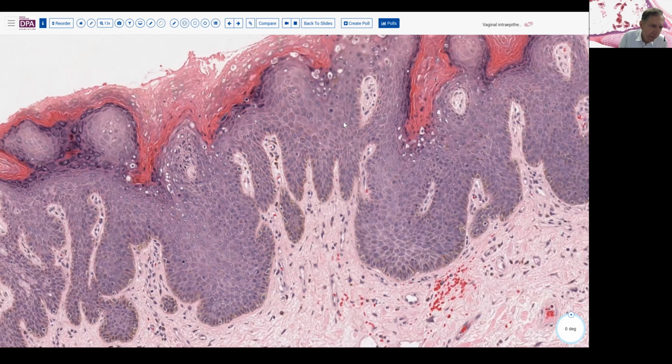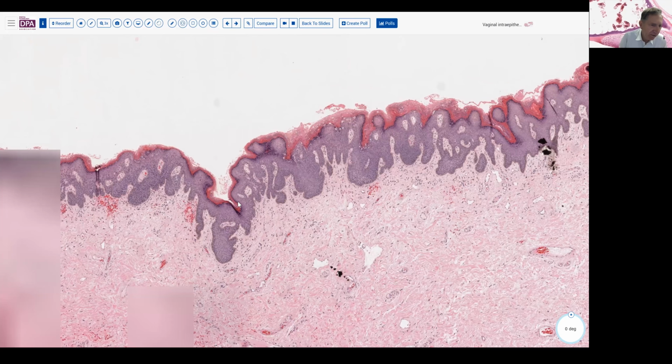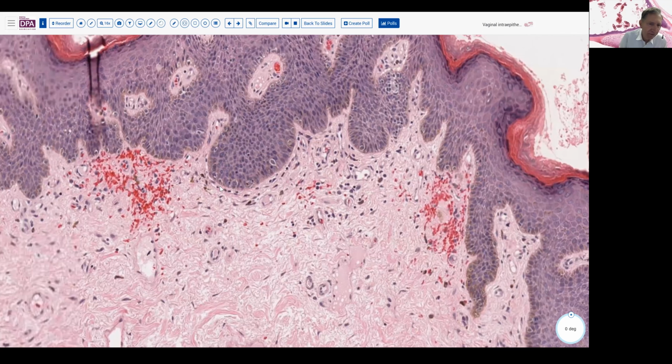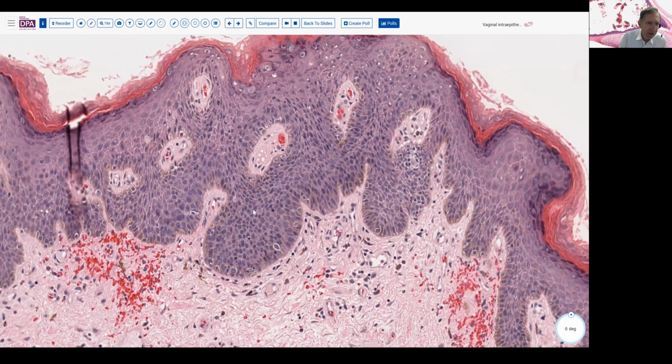One thing I will comment on is that if we see atypical mitotic figures, that is usually always associated with a high-grade lesion. So if you see, even in the base, even at the basal layer, a tripolar mitotic figure or a ring mitosis or something like that, you can fairly confidently call that a high-grade lesion.